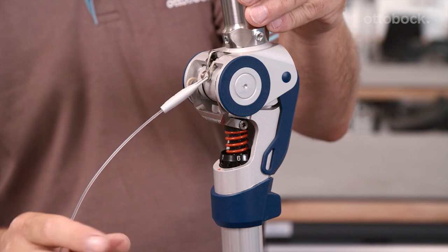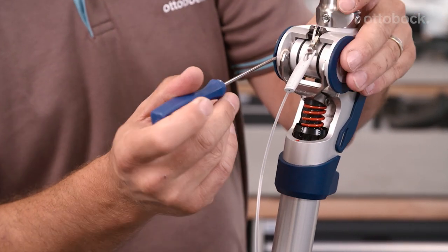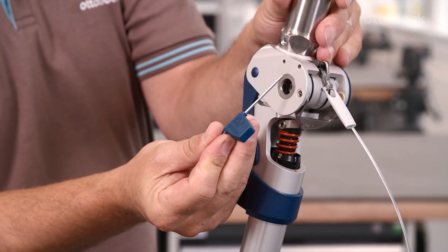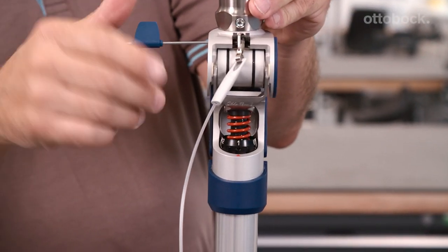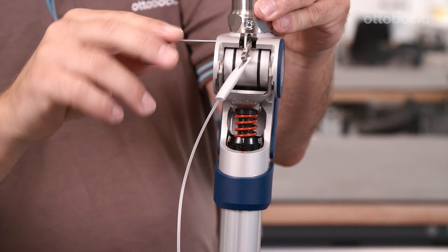To permanently activate the lock on the joint, use a screwdriver to carefully remove the blue cover cap that is on the left side of the joint in the walking direction. Then move the knee joint to a fully extended position and use the adjustment wrench to unscrew the set screw. Finally, reattach the cover cap. The locking function is now permanently activated.